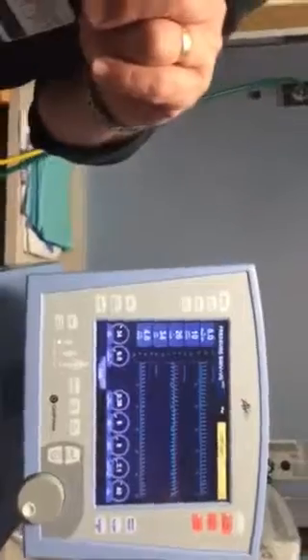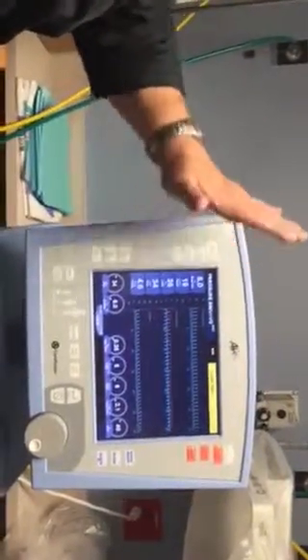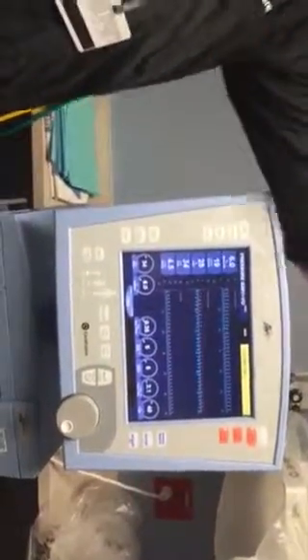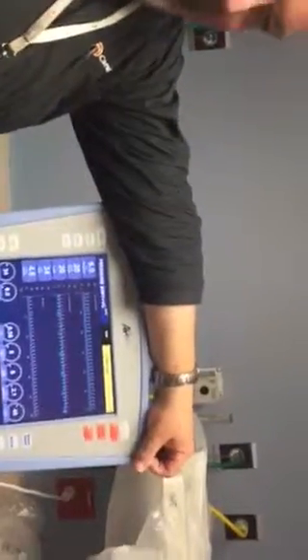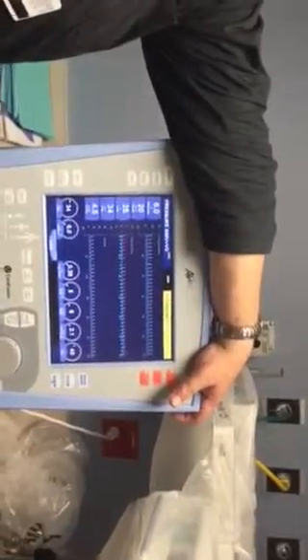In your blood gas lab is a new binder. It has this step by step, so if you want to put it on, it will take you step by step on how to do it. It also does non-invasive and nasal CPAP too. So everything we just went over, it has pictures of the screens and it'll tell you exactly what to do. And that's volume guarantee, guys.